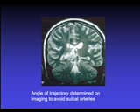Coronal views for either CT or MRI are important to develop trajectories for safe passage of an instrument from the surface of the brain down to the target. In general, we try to avoid sulci or ventricular surfaces where small arteries may be present.